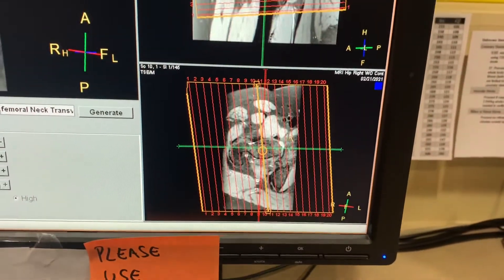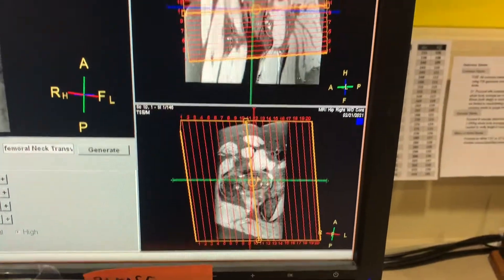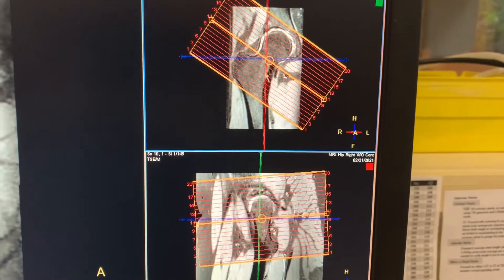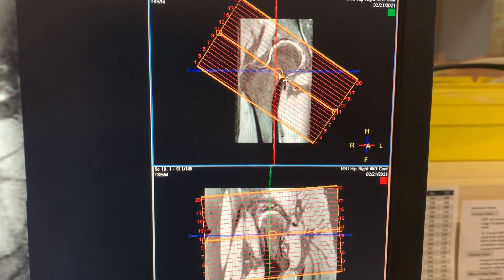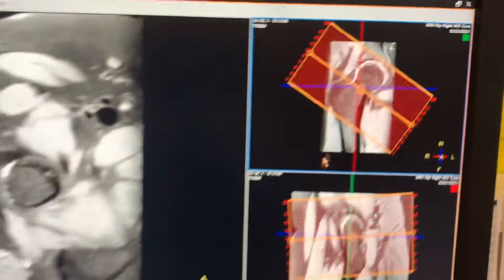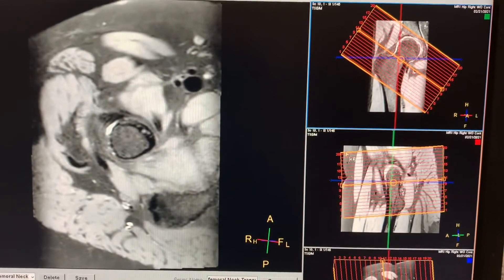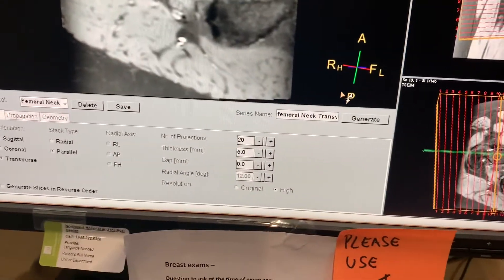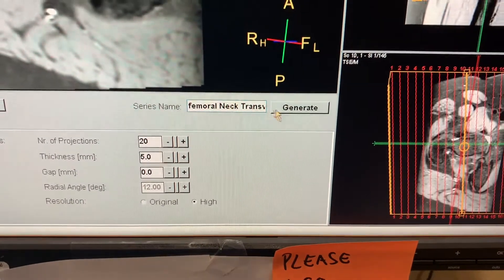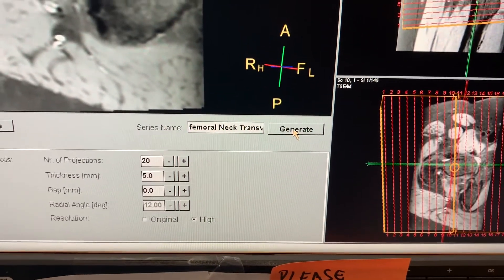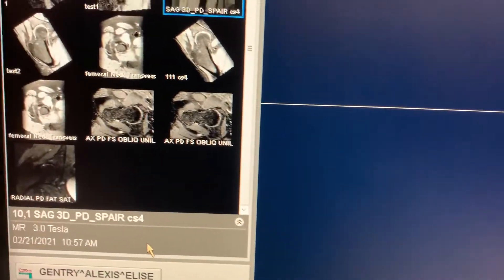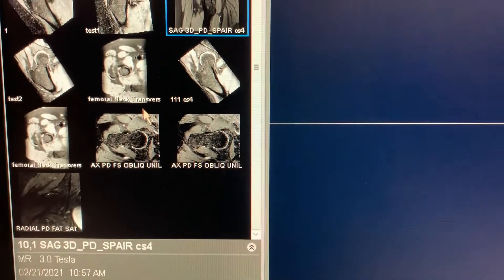Ignore the third view completely — that's just a double oblique view and it will confuse you. Focus only on the two relevant views. Center it a little more, rename it 'femoral neck transverse,' and hit generate image.